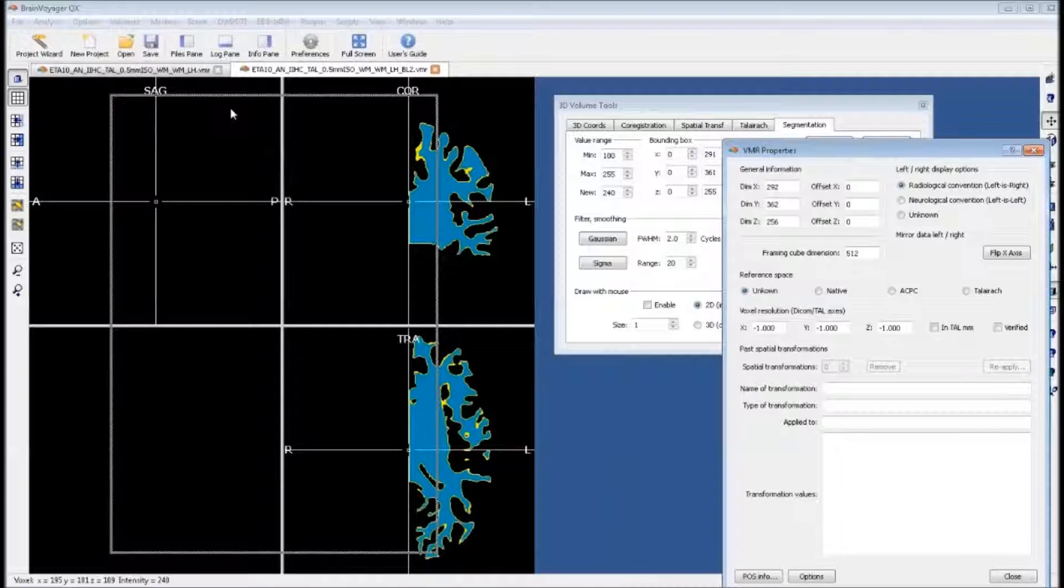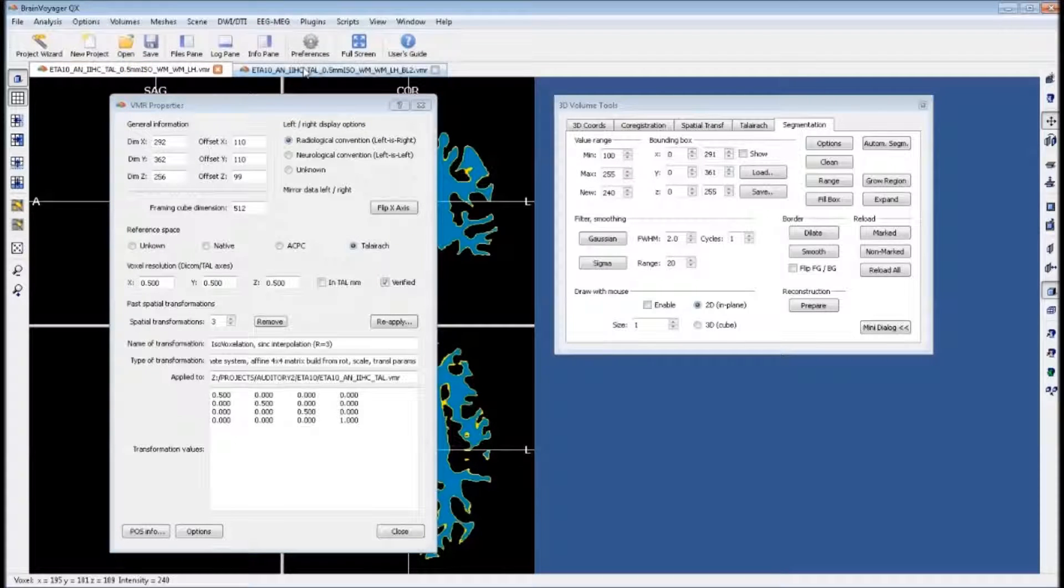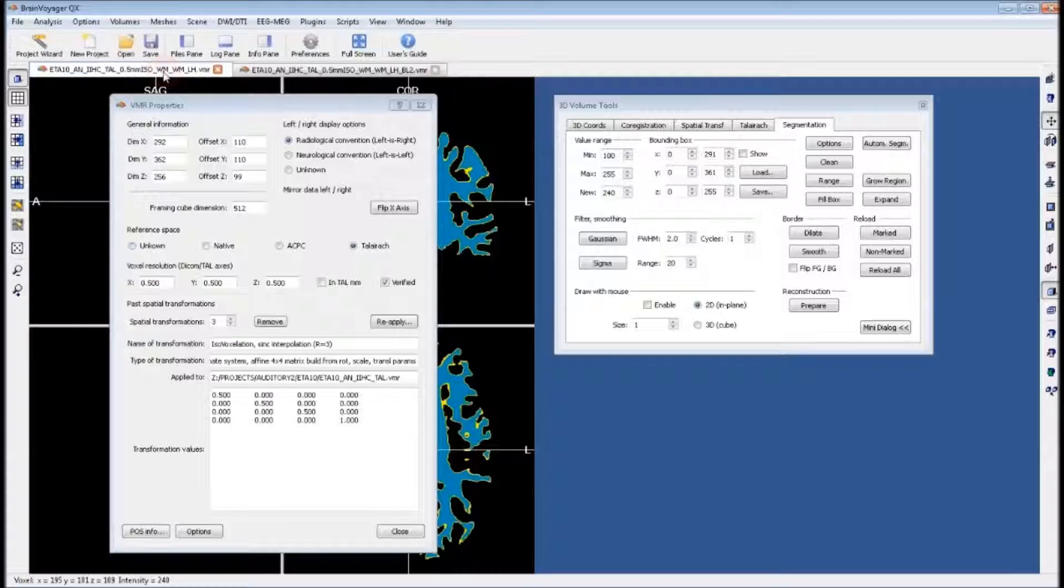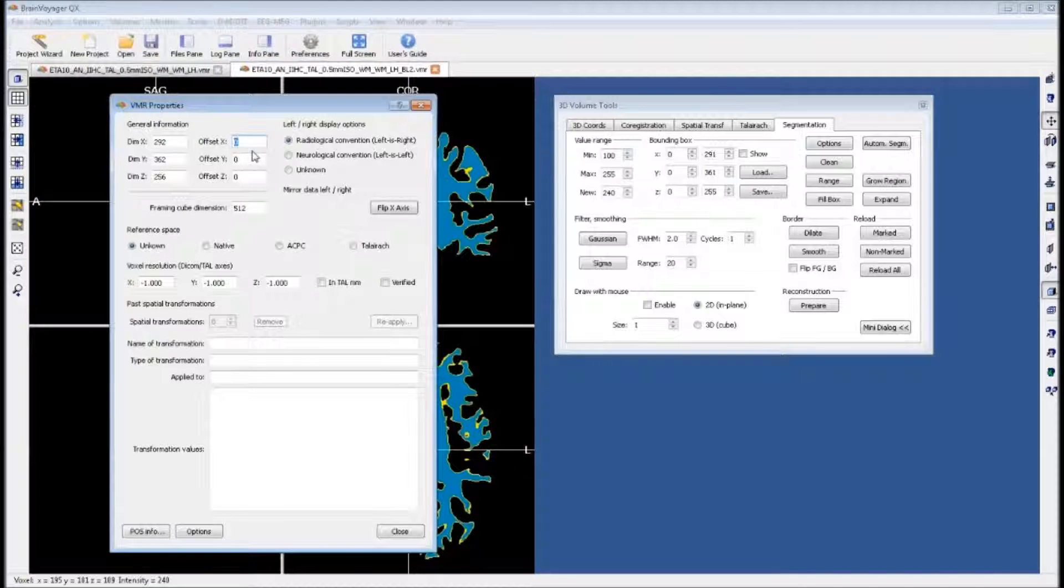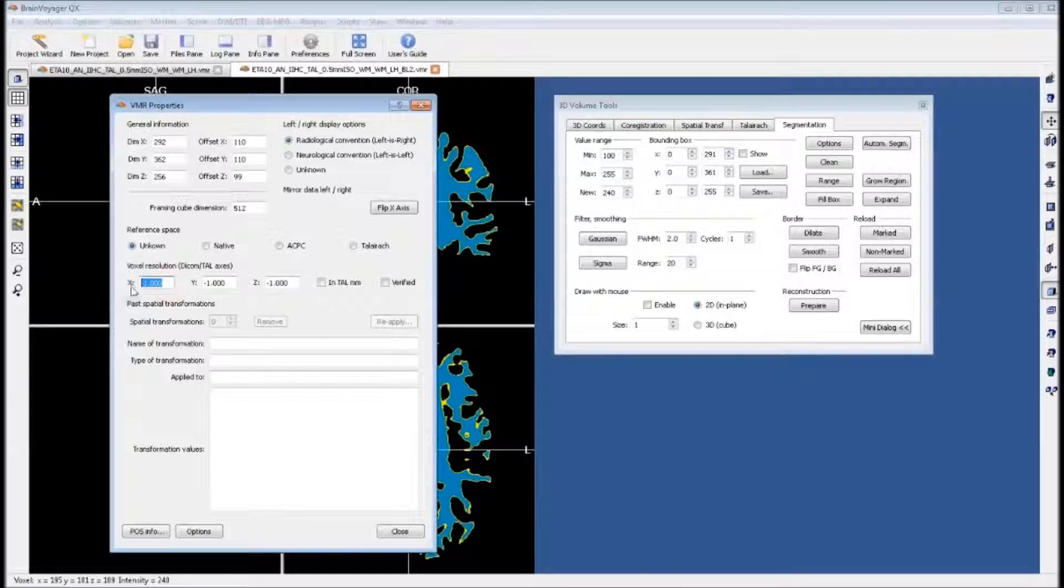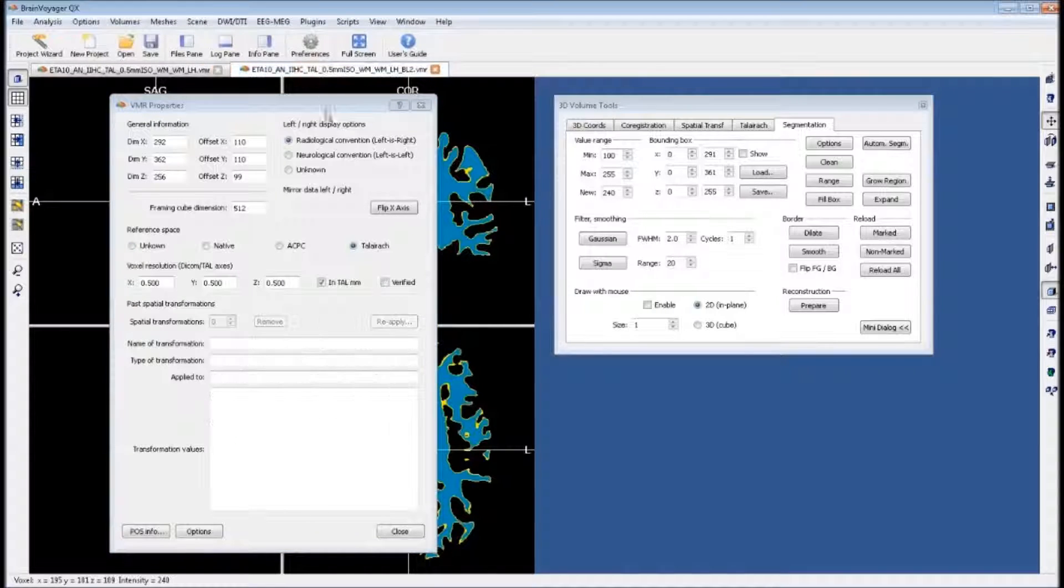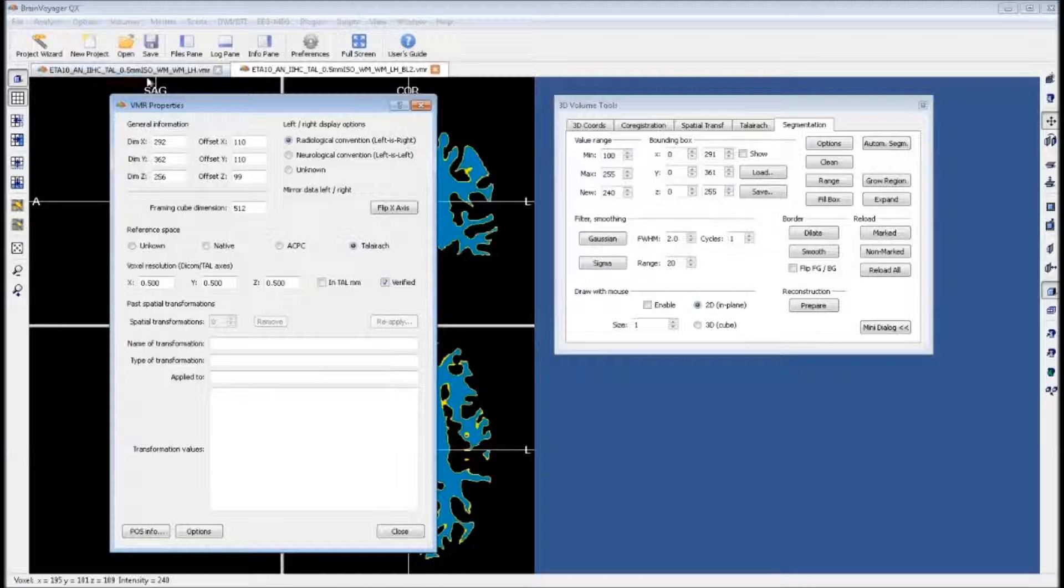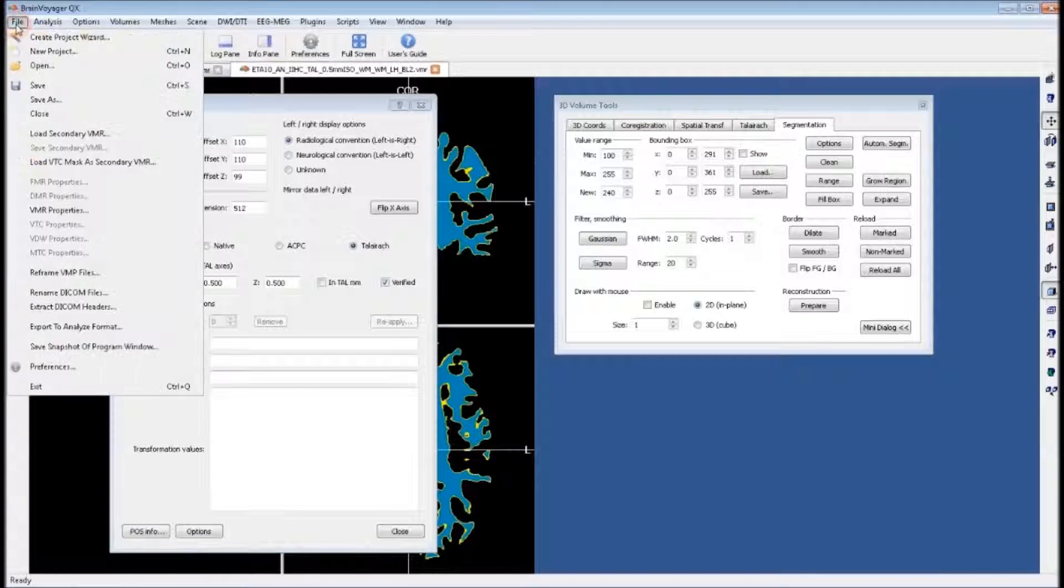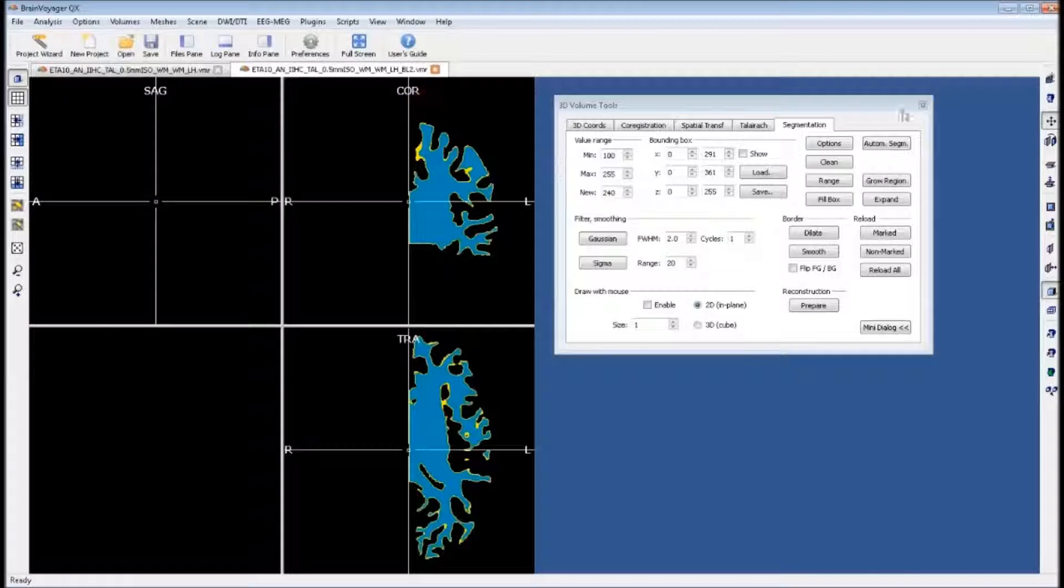If you're going to file and click on VMR properties, you'll see that it hasn't carried VMR properties over to the newly created file. So what we want to do is copy these over by inputting them manually. We want to just double check that these are correct. You can see that this part is wrong, so we'll change that. Otherwise, it looks pretty good.